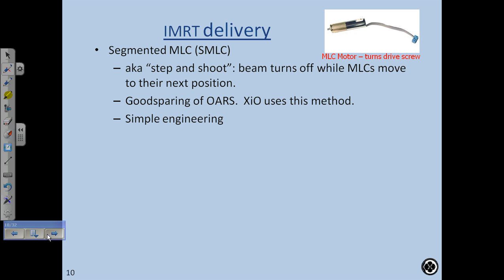And the engineering is simple. In other words, there are fewer things happening simultaneously. In other words, when the MLCs are moving, the beam is off. Okay, so it doesn't have to keep track of dose rate.